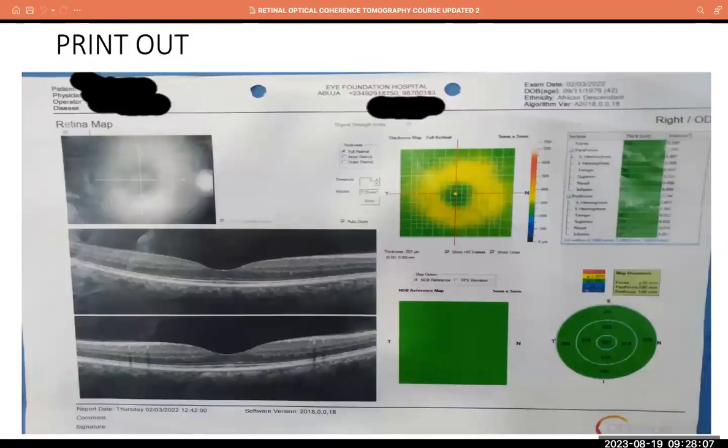If you're given an image where the intersection of the lines is not on the fovea, then you may make a wrong impression of the diagnosis. But that also comes into play saying you should be ahead of the game. You've examined, you have the history.